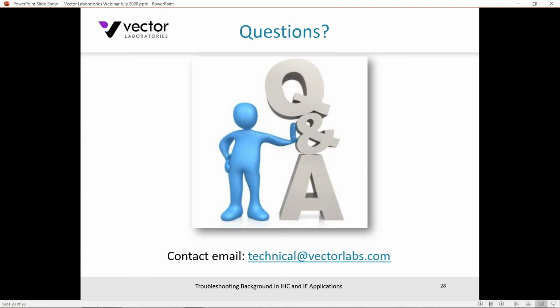All right, thank you. The next question. For quenching whole mounts, what is your take on using a solution of formamide and hydrogen peroxide? Yeah, it sounds like that will be using a detection methodology with an enzyme-based system. You wouldn't be using that, of course, for immunofluorescence. I have not run that myself personally.